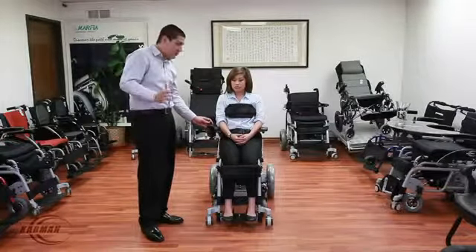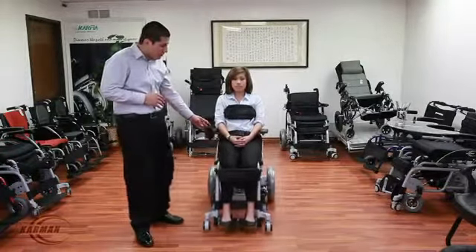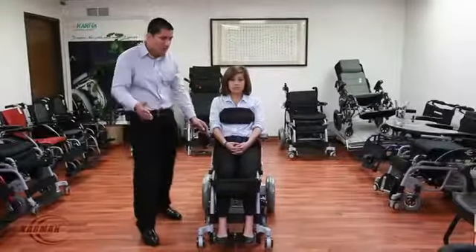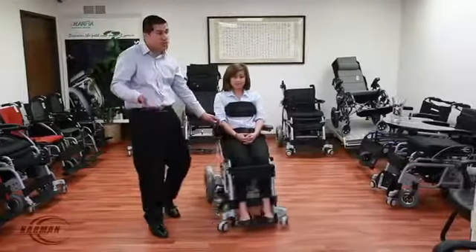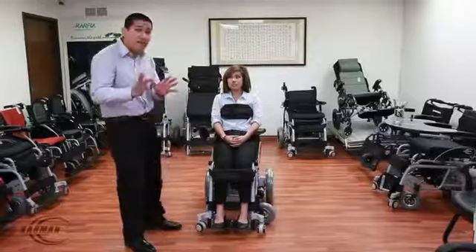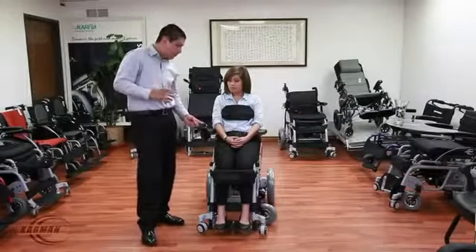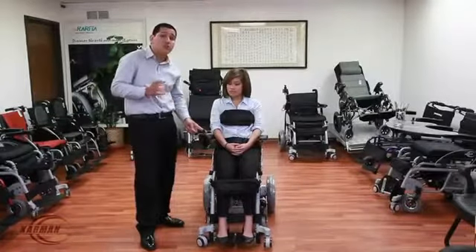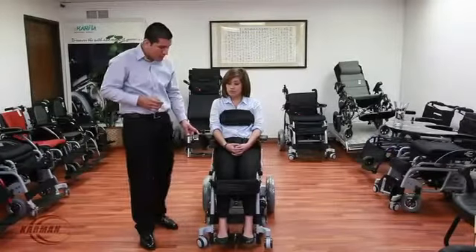This chair is in drive mode at the moment. You can control the speed — you can go forward, backward, left, and right. This chair is very easy to maneuver. It has a very sensitive, cool-to-the-touch joystick right here. Very easy — you can control how fast, how slow.